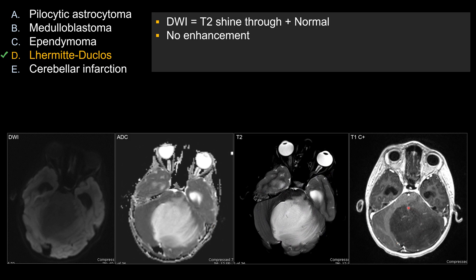On post-contrast sequence, Lhermitte-Duclos classically does not show any enhancement, or if it does, it tends to show only mild vascular enhancement. You should never see a discrete enhancing mass lesion or an enhancing mural nodule. If you see that, consider something else.